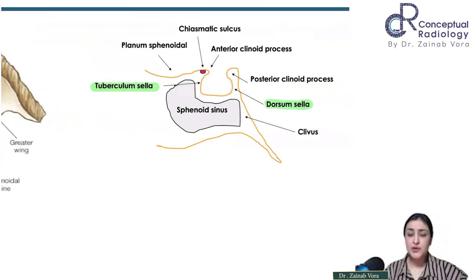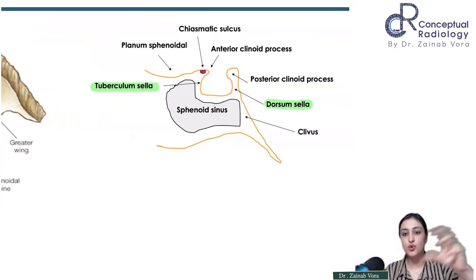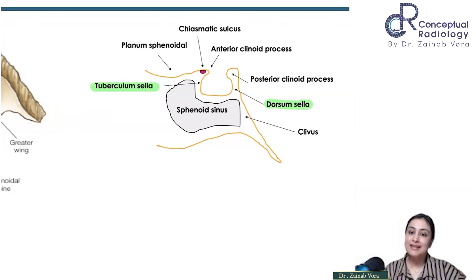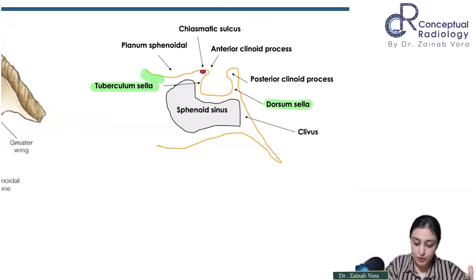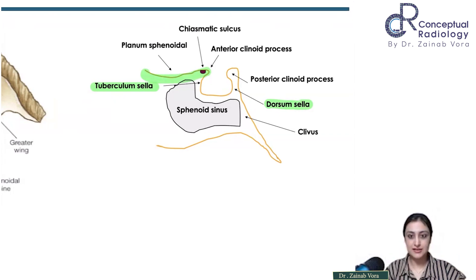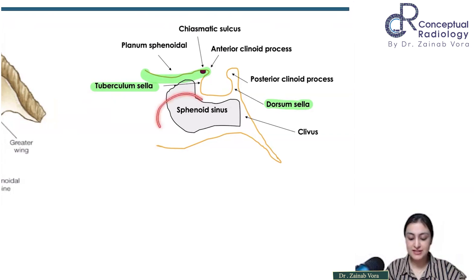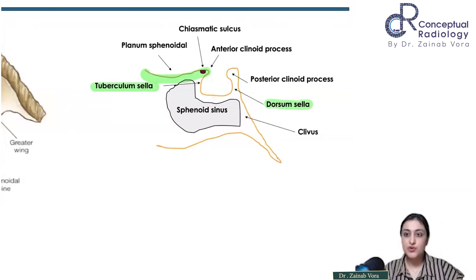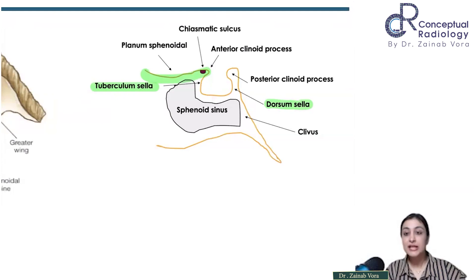These are the bony landmarks you need to know on a radiograph or CT. On MRI the focus is on the pituitary itself, but on CT and X-ray all we can see is the bony sella, and we extrapolate findings from there. The bone of sphenoid you see here is the planum sphenoidale, with a small chiasmatic sulcus anteriorly. Below the sella lies the sphenoid sinus. We've already discussed sphenoid sinus pneumatization — whether it is pre-sellar, sellar, or post-sellar — in our PNS imaging class.